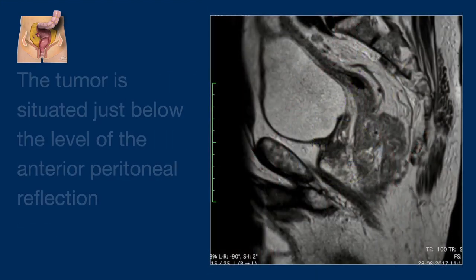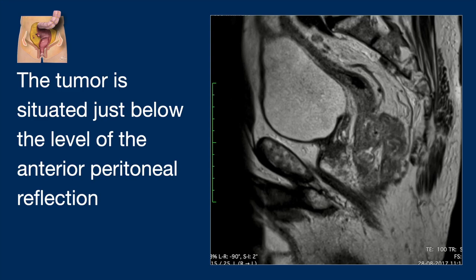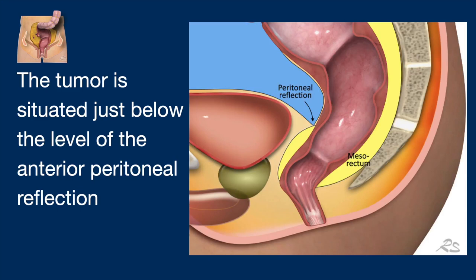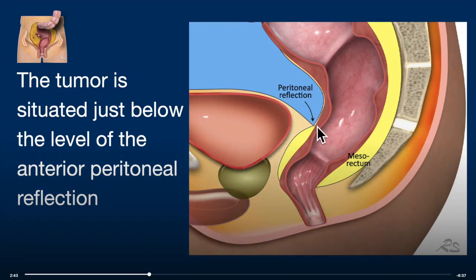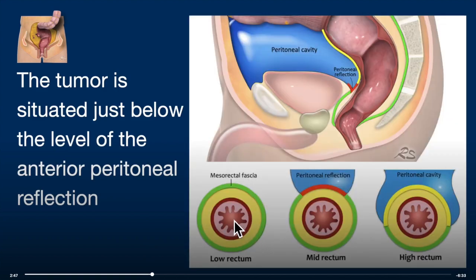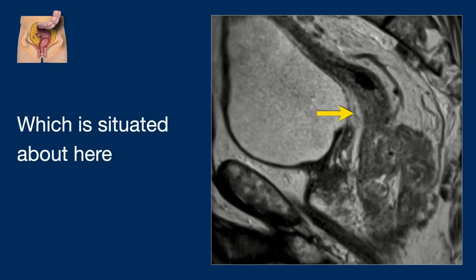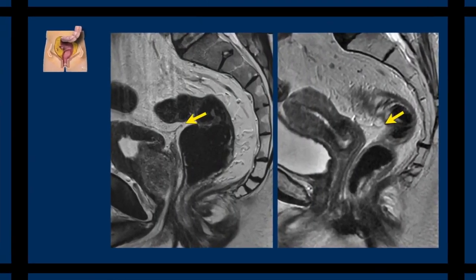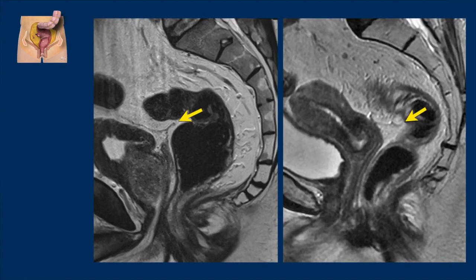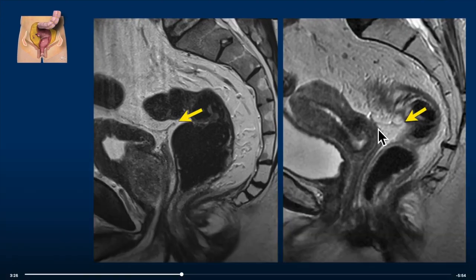The tumor is situated just below the level of the anterior peritoneal reflection, which is a very important landmark. Tumors below the peritoneal reflection can only extend into the mesorectal fascia, while tumors at or above this level can extend into the peritoneal cavity. Let's see if we can find this anterior peritoneal reflection — it can be very difficult to find, but in another patient it is far more easy to see.